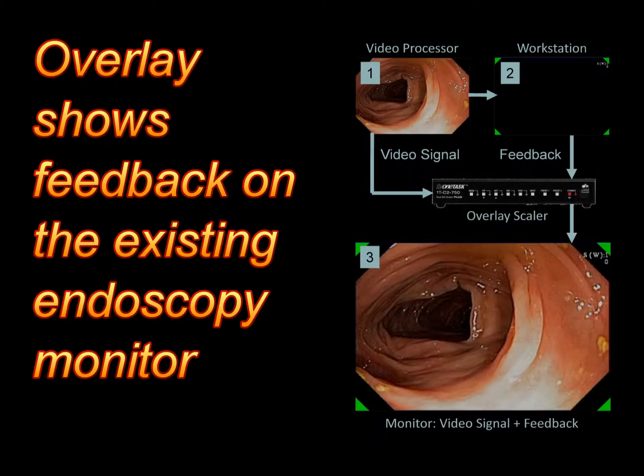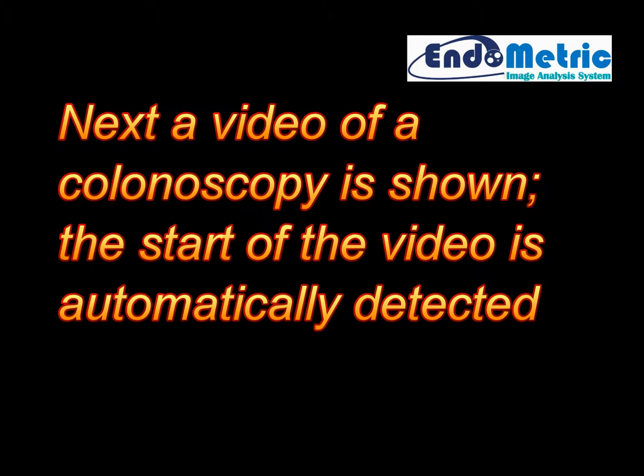Overlay technology similar to technology used by the NFL during football games on TV shows feedback on the existing endoscopy monitor. Next, a video of a colonoscopy is shown. The start of the colonoscopy and thus the video is automatically detected.